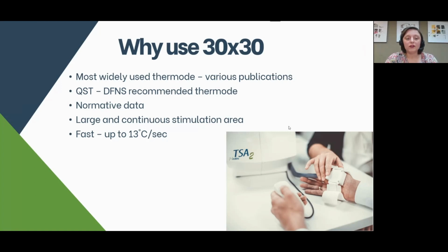And as I mentioned, this thermode size is recommended by the DFNS since it gives the most robust and sensible stimulation, and since all the data until now was collected with these or similar thermode sizes.